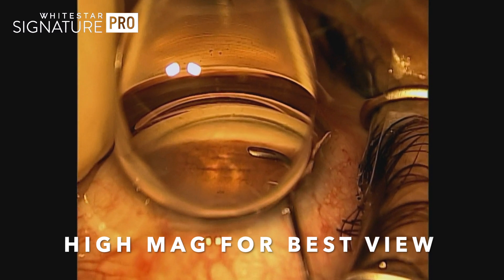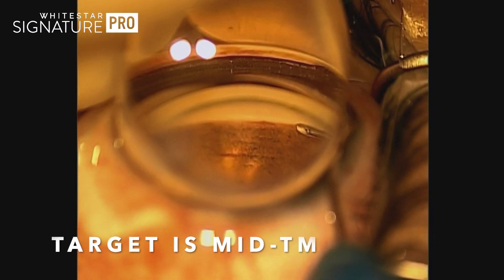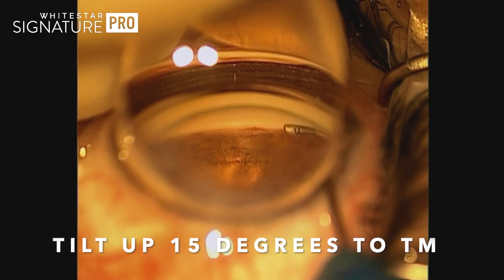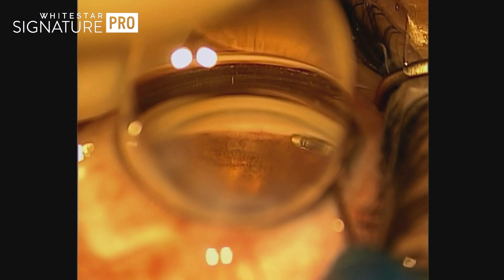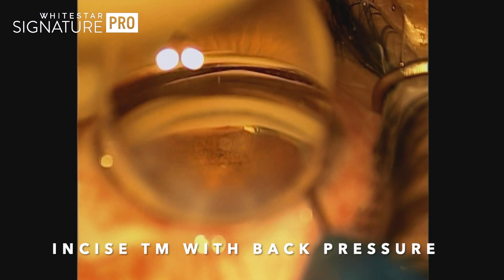High magnification is really important — getting a good zoom in so you can see the details of the trabecular meshwork. Here we're going right in the middle of the TM; we want to target that, aiming 15 degrees up, pointing into the canal.